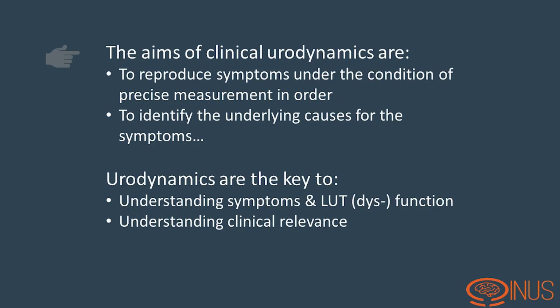What are the aims of urodynamics? The aims are to reproduce symptoms under the condition of precise measurements in order to identify the underlying causes for the symptoms and findings. Urodynamics are indeed the key to understanding symptoms and bladder dysfunction, as well as understanding clinical relevance.